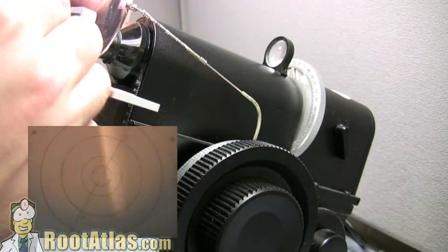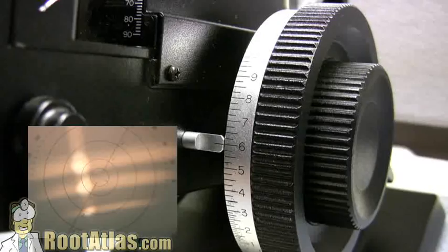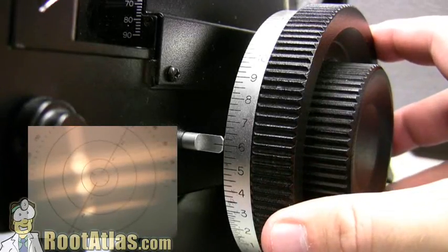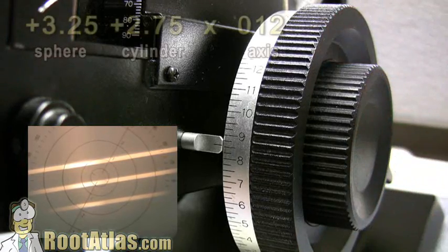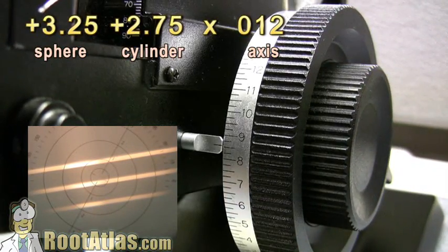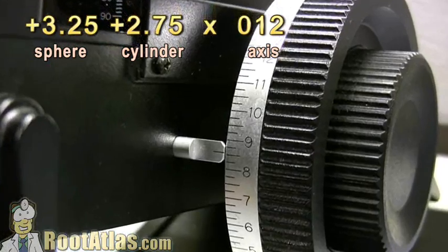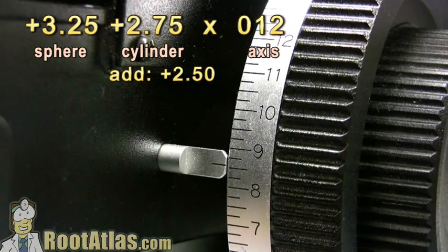Now to get the bifocal power, you need to move the glasses up to the bifocal segment and see how much you need to change it to get those three fat lines in focus again. So we went from plus 6 to plus 8.5, meaning our add is plus 2.5.